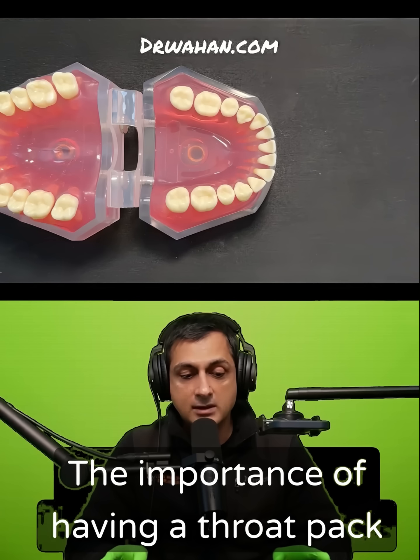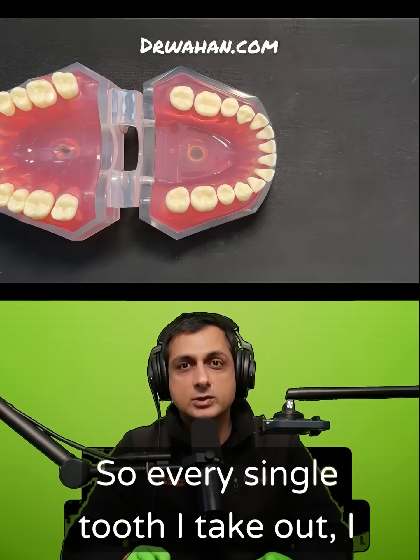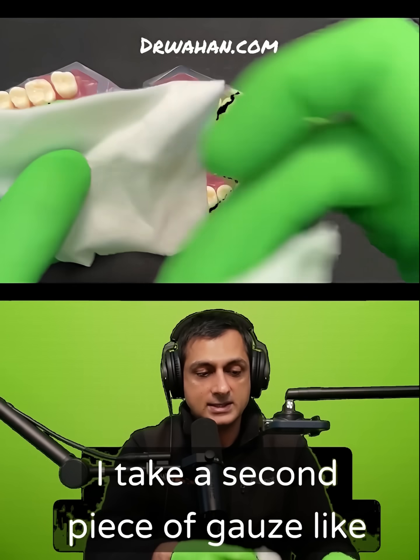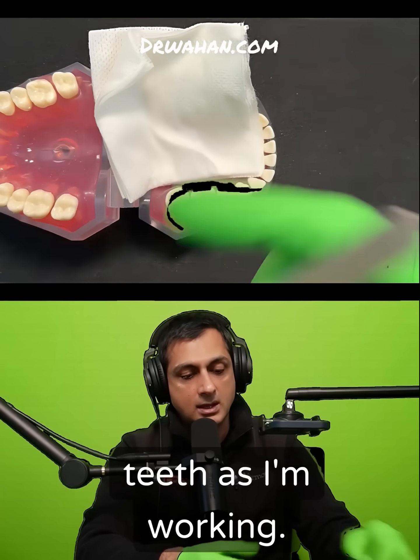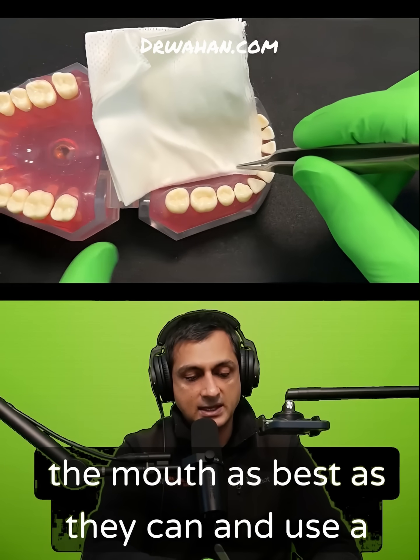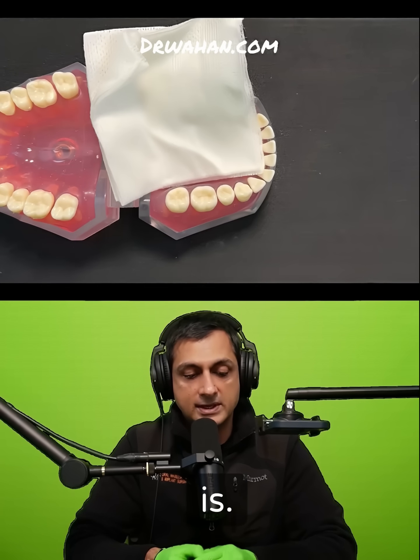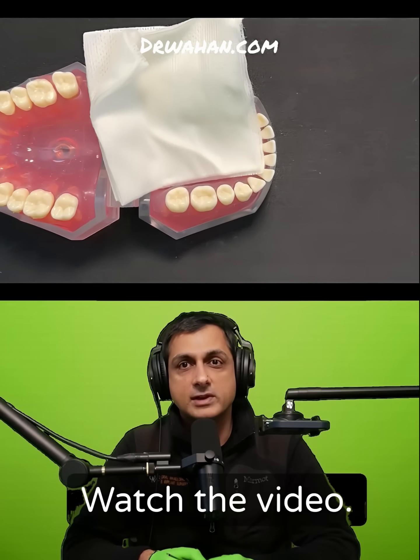The importance of having a throat pack is paramount. Every single tooth I take out, I use a throat pack. What I do is I take a piece of gauze like this, take a second piece of gauze, and just tuck it in lingually behind the teeth as I'm working. Tell the patient to gently relax the mouth as best they can, and use a cotton plier or something like that just to tuck it in. And there it is — that's all you need. Use it every single time you take a tooth out.